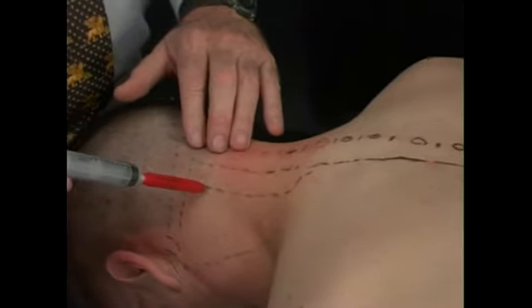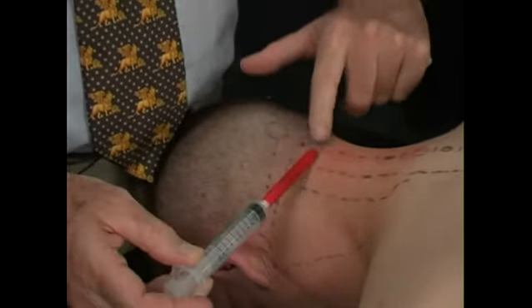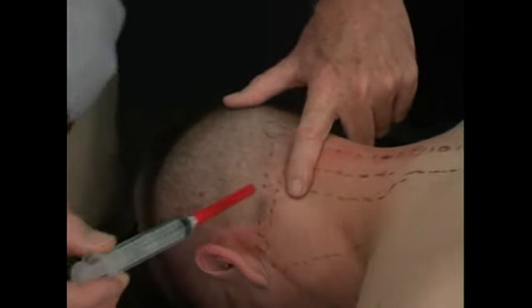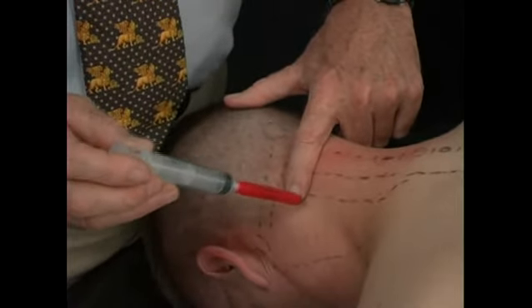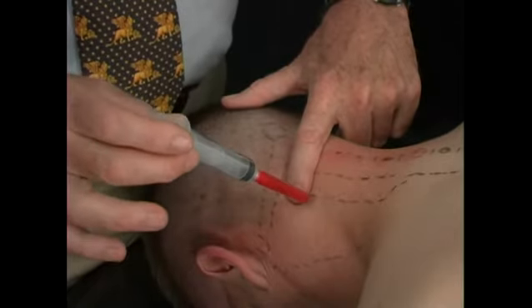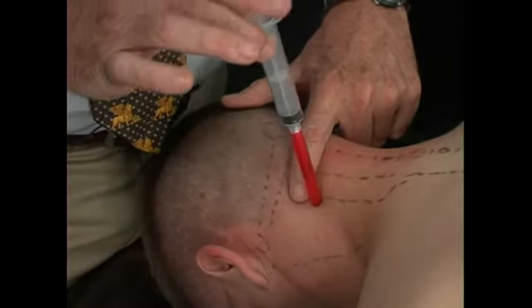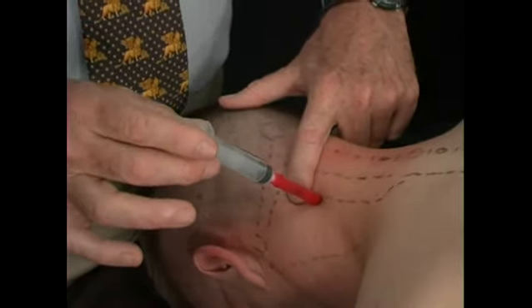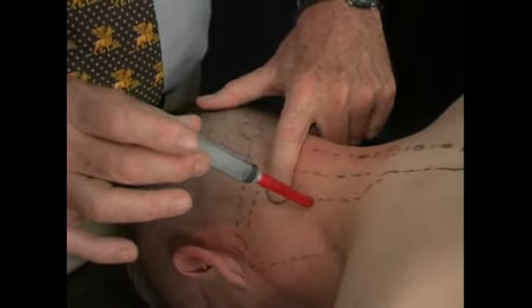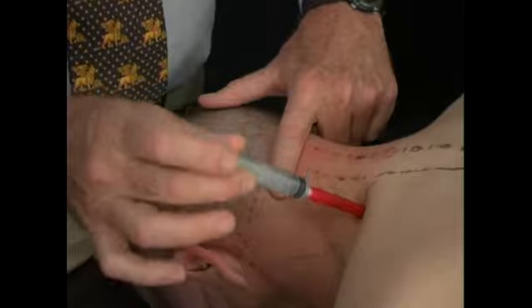We then move to our facet area, and again, knowing that we're going to stay below C2, if we think this is C2 right here, we stay below that area because of the vital structures and the ease of getting into the cord above this area. The vertebral artery also comes up and is quite open in this area. Our injections here again are 30 to 45 degrees medially. Here's perpendicular, and the injection is about like this, going in gently till we hit the facet in this area, and then we walk down with 4 or 5 injections on the facets right down the cervical spine.